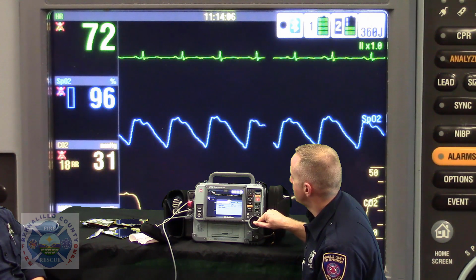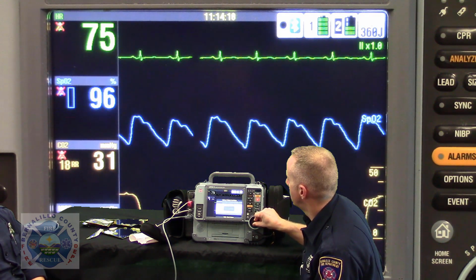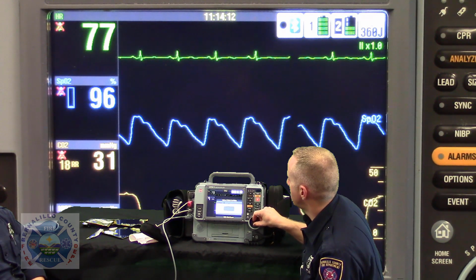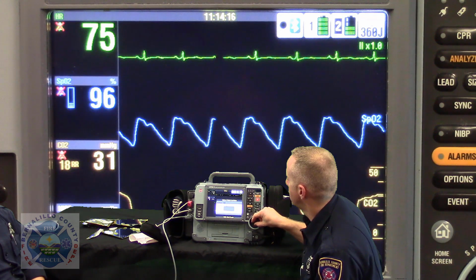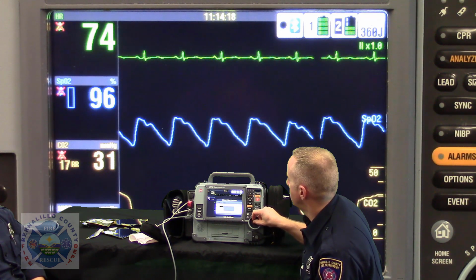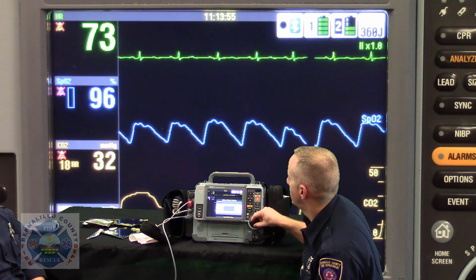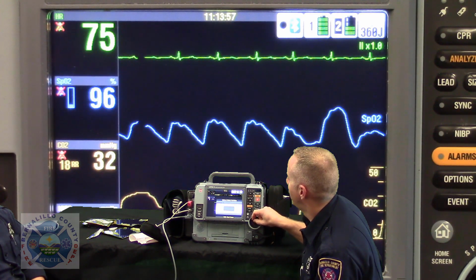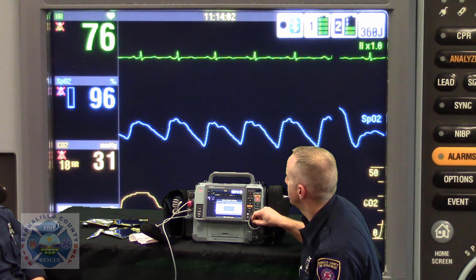So here I'm going to hit options and patient, and we're going to enter our patient name. This, of course, is going to be Vanessa Smith. Thank you, Ms. Smith.